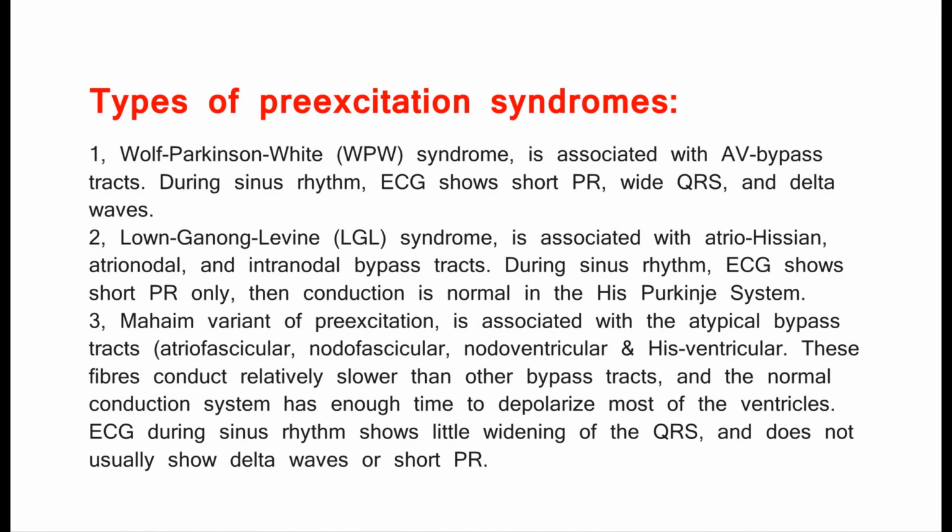Types of preexcitation syndromes. 1. Wolff-Parkinson-White, WPW, syndrome, is associated with AV bypass tracts. During sinus rhythm, ECG shows short PR, wide QRS, and delta waves.